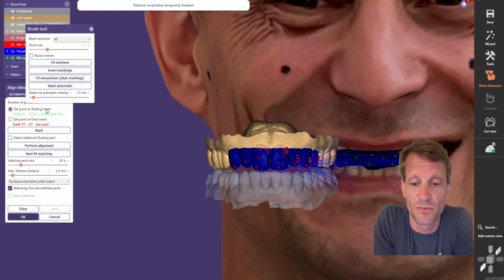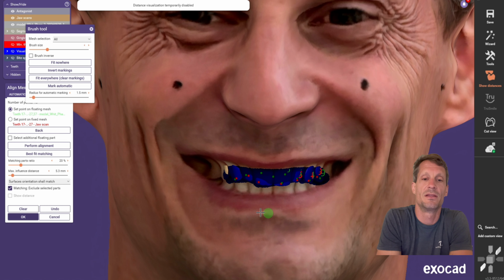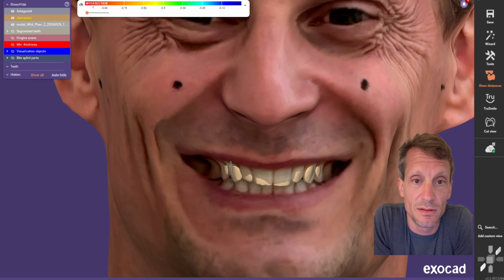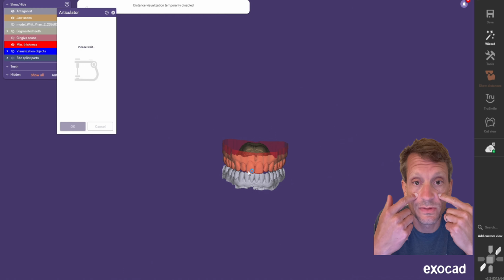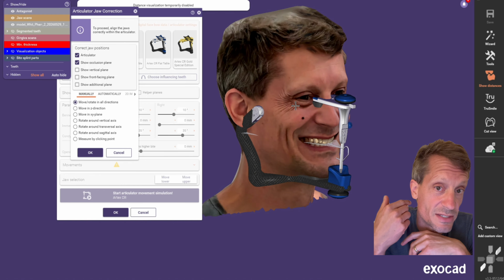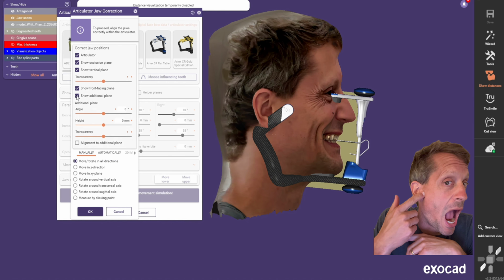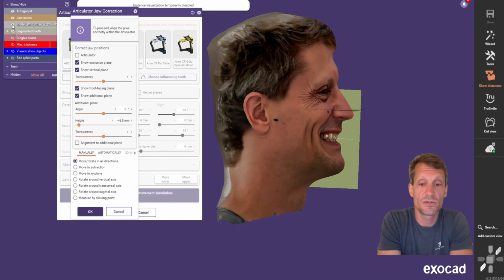And then you can perform the alignment, double check it, and there we go. And the markings on my face there, right, are the infraorbital notch where the nerve is going to exit in the face, and approximate area of the hinge axis where I just opened, marked the middle of the depression. And those are really helpful.